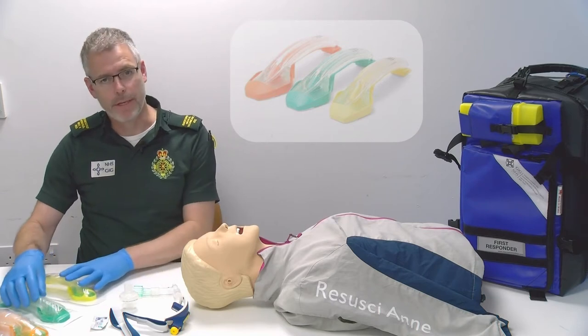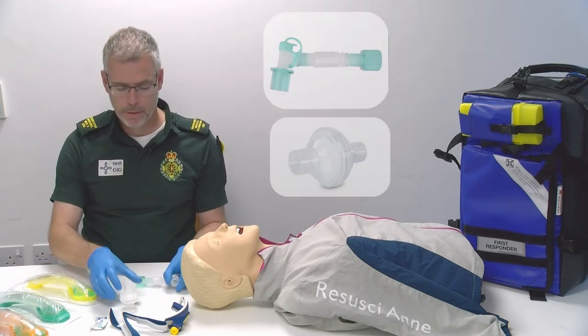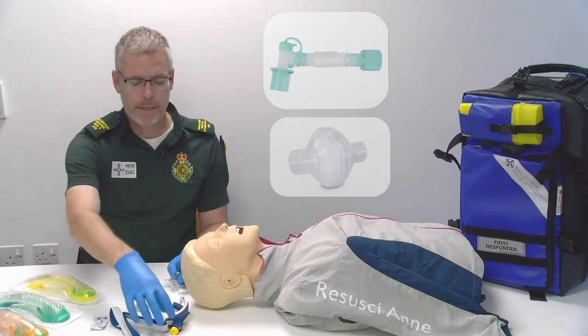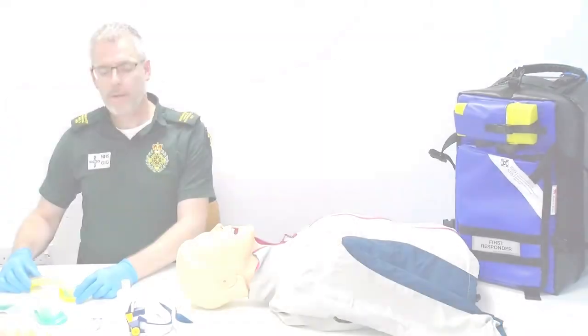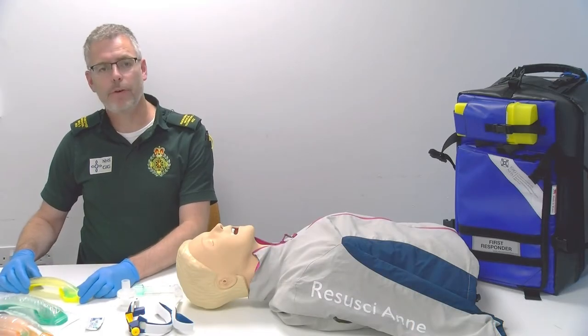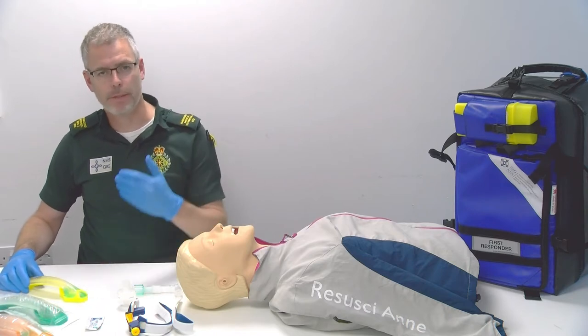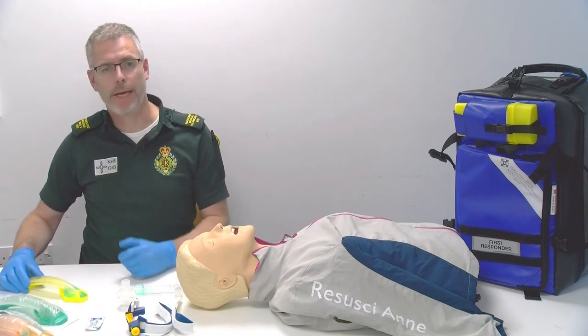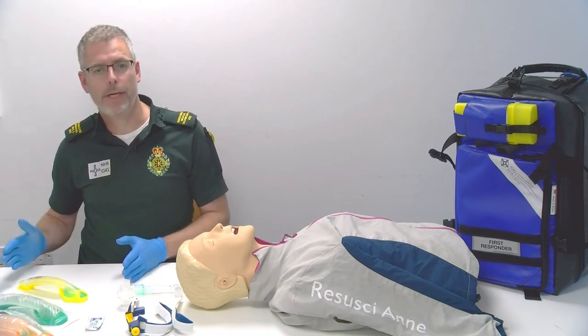Together with the iGels we have the catheter mount, the bacterial filter and the Thomas clamp. We're going to look at the criteria for the use of iGel, which forms part of the stepwise approach to managing your airway in an unconscious patient or use in a cardiac arrest patient.